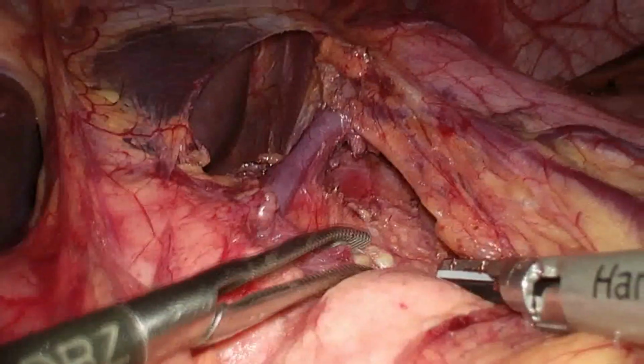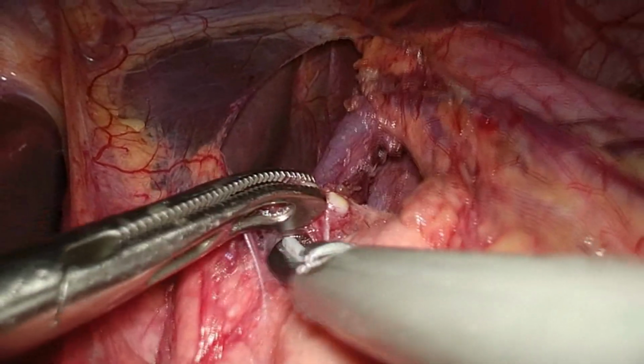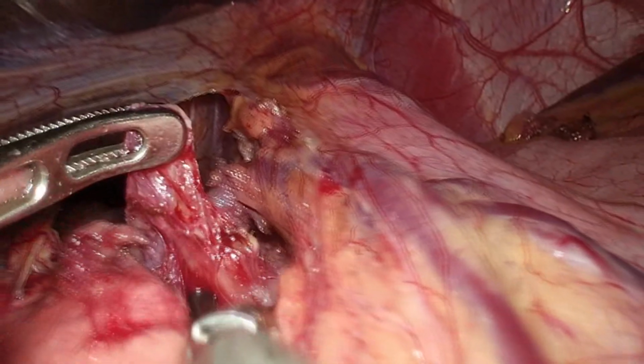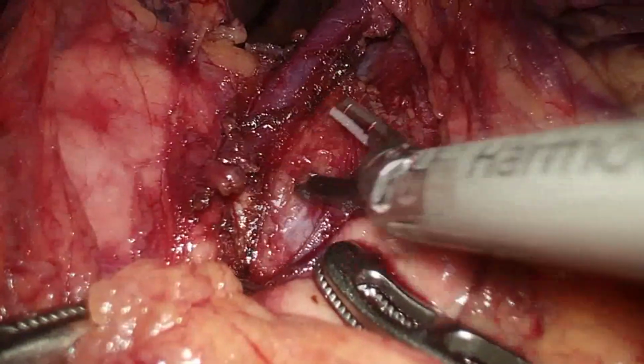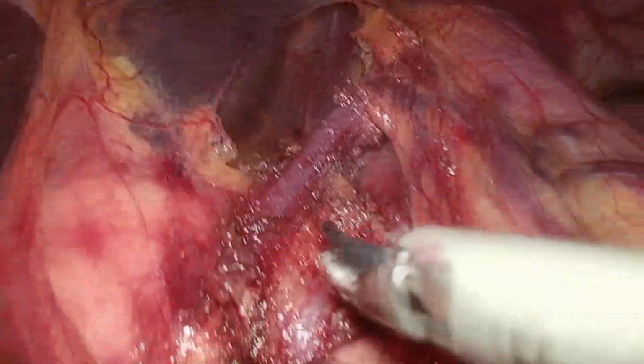We also encountered 2-3 lymph nodes in this area. They were reactive, and we excised them too. This is again an additional lymph node on the superior border of the lesser curvature of the stomach. So we send this for histopathology. They were reactive.